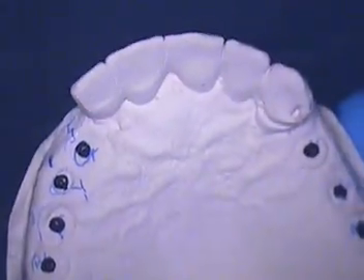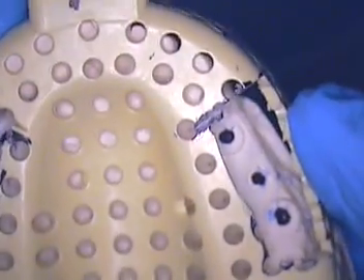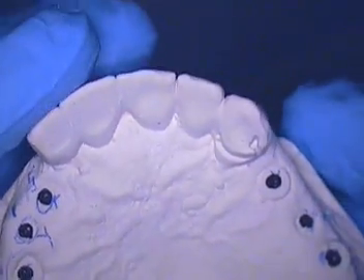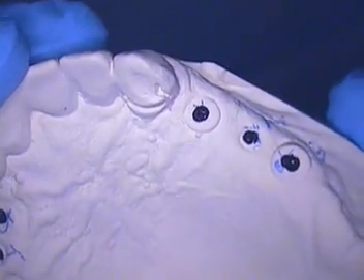We're going to move right to our instrumentation now. I want to tell you that a good study model and knowing where the implants are placed are important. The next thing we need to do is get our tray ready — I'll go ahead and get a tray cut out immediately because I know I'm going to be doing an open tray impression. And then we need to not only get the impression but also bite registration copings. I'm going to show you a little bit of everything right now, and then maybe even film this case today for you to watch.